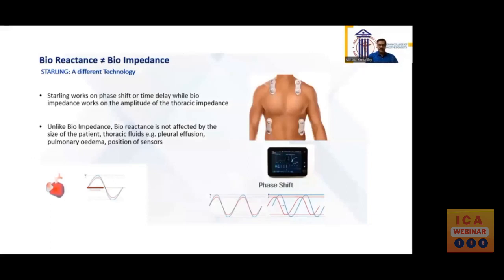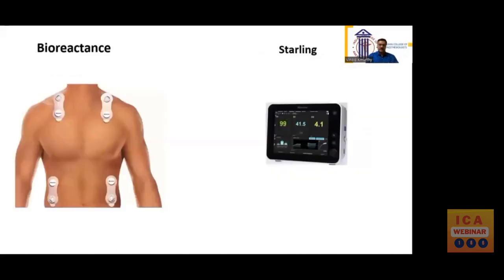It is not affected by the size of the patient, thoracic fluids like pleural effusion or pulmonary edema, or by the position of the sensors. The first version of the non-invasive cardiac output monitoring, that is the NICOM, was first manufactured by Cheetah Medical in Massachusetts. This has been used as a reference standard, which has been validated with other cardiac output monitoring systems like the thermodilution and the pulse contour analysis.